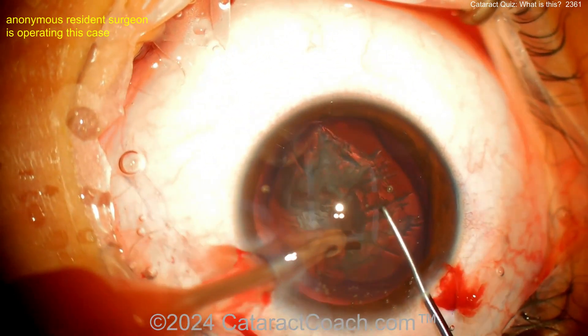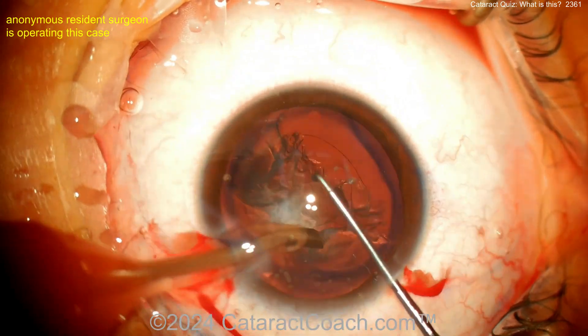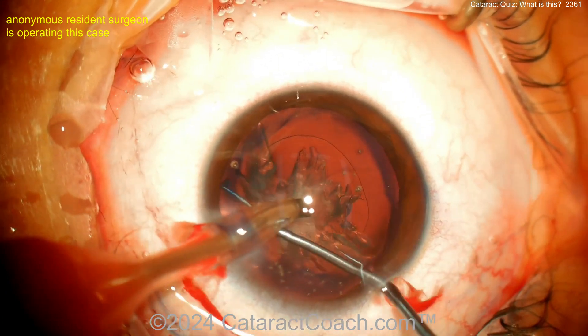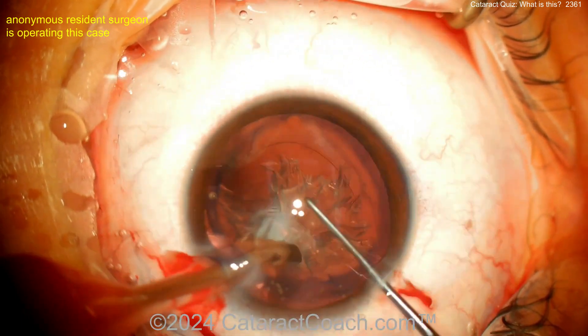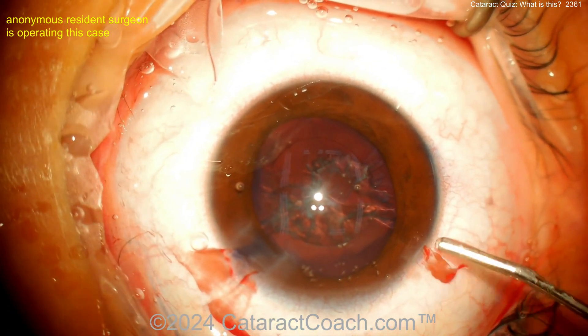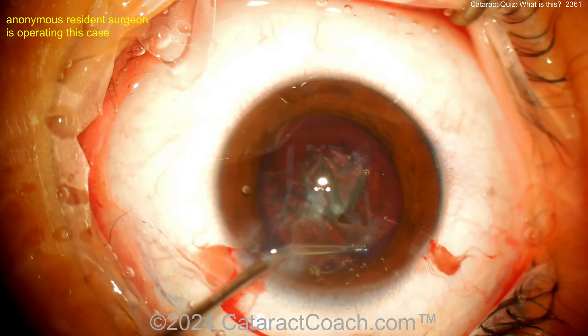A phaco probe is going into the eye. No IA — just the phaco probe. Look how soft this is — you could have easily done this with the IA probe. I would not have used the phaco probe here; I would have used the bimanual IA approach. You'll be able to get all that lens material out with just the IA probe. With a phaco probe, just be careful — the last thing you want to do is puncture the capsule.